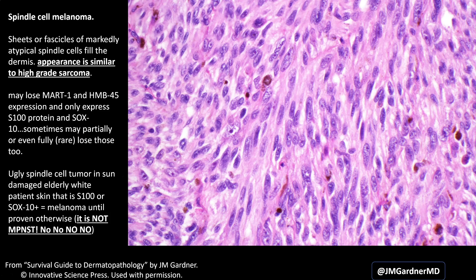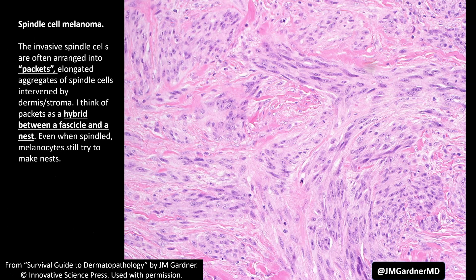For comparison, this is what spindle cell melanoma looks like - it is cellular and spindle-shaped, resembling a sarcoma, and is much more cellular than desmoplastic melanoma.